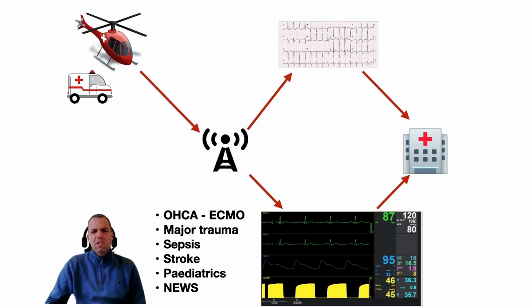It allows the receiving hospital team with the respective experts to gain much better situational awareness of the patient before they even arrive. It's as if they've been following the patient through. And all of the parameters that we see on the screen can then be amalgamated into a new score. And we're going to come back to that. I think it's really important that we have a new score displayed.